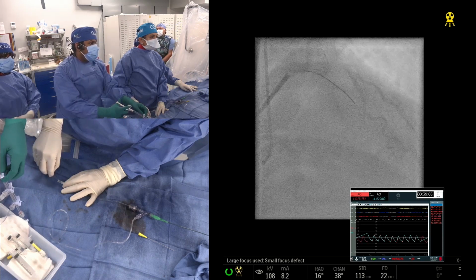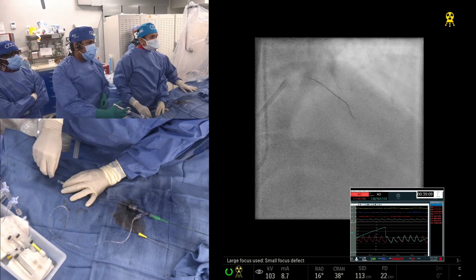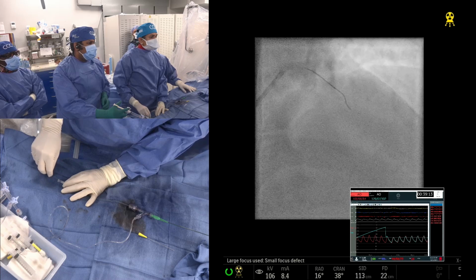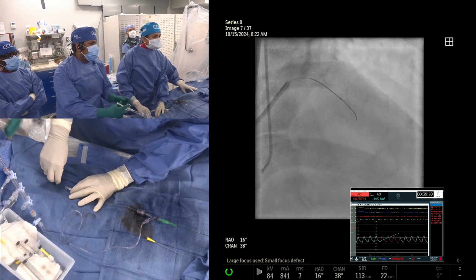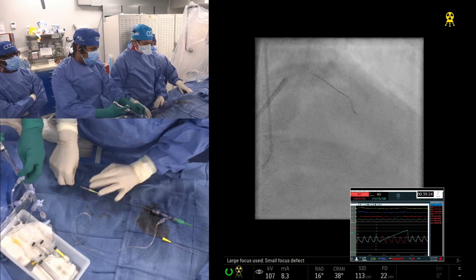Yeah, that's the septal. Actually, today we have the CTO seminar at Mount Sinai. We have 7 CTOs. Usually we are very careful about 3 or 4 maximum, but today by chance they happen to be 7 CTOs on the schedule. This is the first one to start. Both of you will glow in the dark tonight. I already told them that I'll be here past midnight.